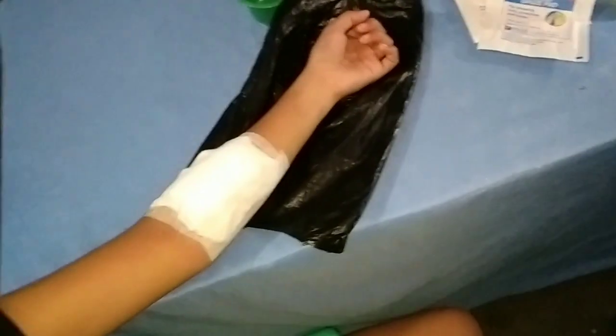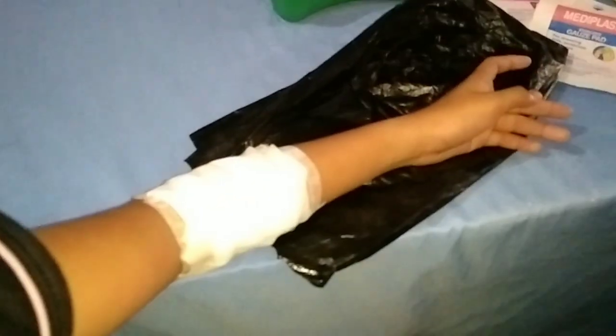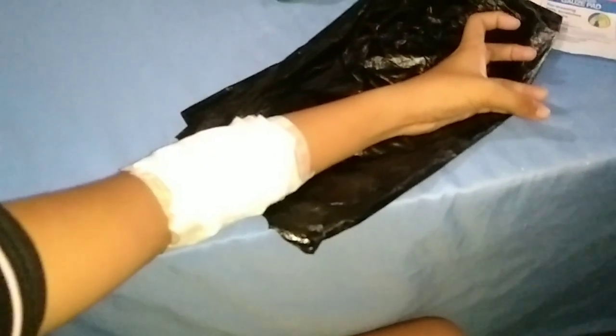Okay, and then after that, record on the clinical chart the taking of the specimen and source. Include the date and time, the appearance of the wound, the color, consistency, amount, and odor of any drainage, the type of culture collected, and any discomfort experienced by the client.